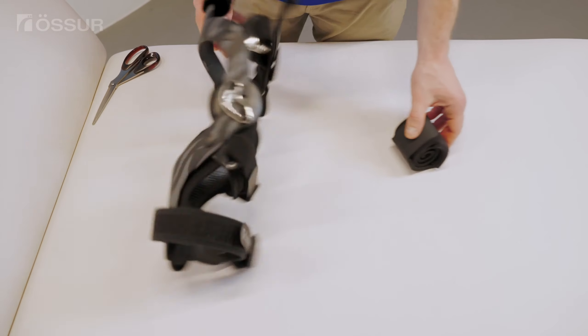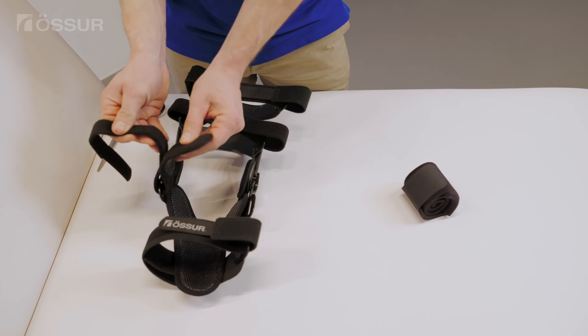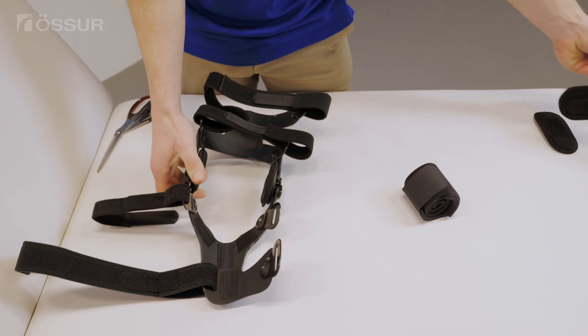The AMS wrap is available in neoprene or EVA. Unfasten the two bottom straps from the outer side of the brace and remove the strap pad from the strap directly below the knee. Remove the tibial liner from the lower frame.